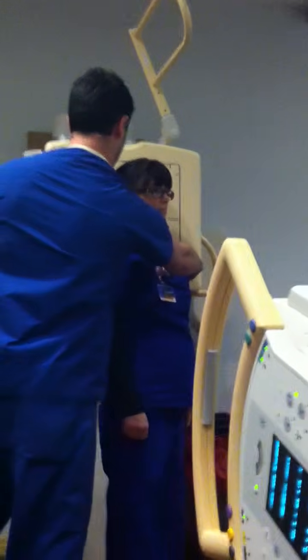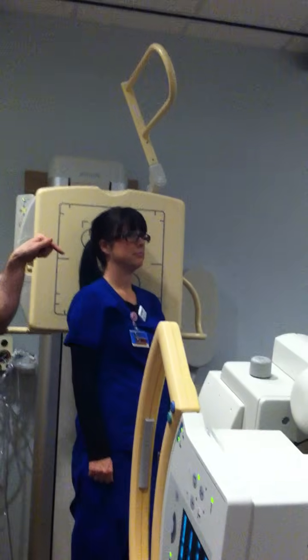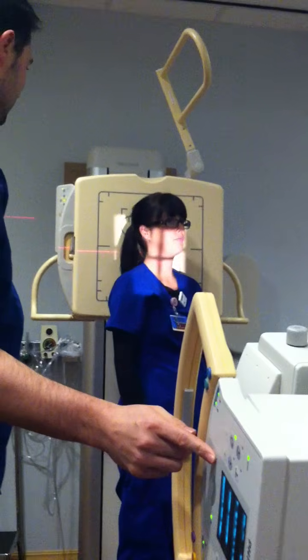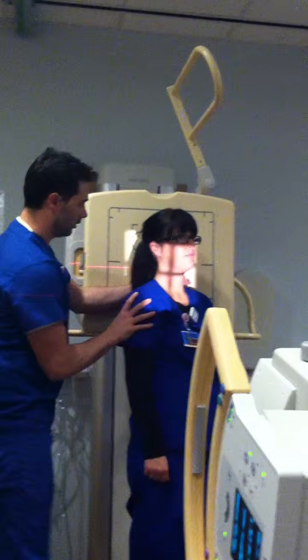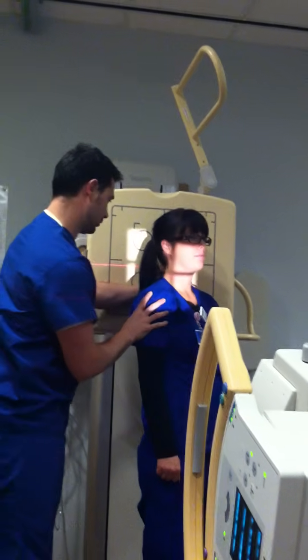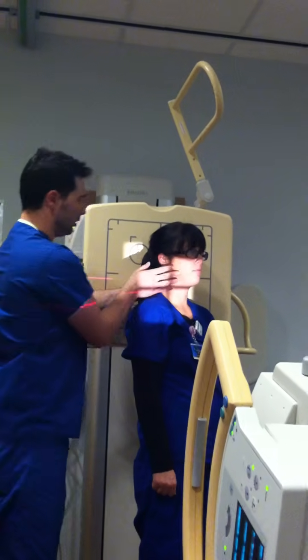Fifteen laying down. I would think your neck would fall. There's more of a lordotic curve when you're upright because you're compensating by holding your head. When you lay down, everything relaxes, so you lose that curve. So we don't need as much. But when you're standing, you need to really get it.